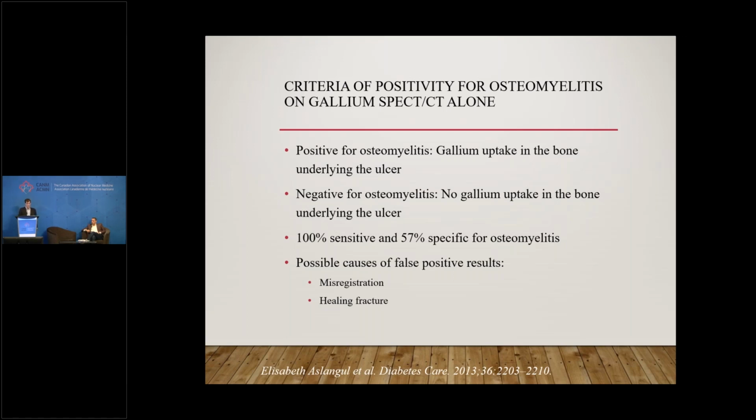The main cause of false positive you have to be aware of is misregistration. So this is very problematic, particularly in the feet. A patient can move, and if the patient moves the foot by a couple of millimeters, you can have a misregistration and an incorrect interpretation. And also, you can have acute fracture resulting in increased activity.